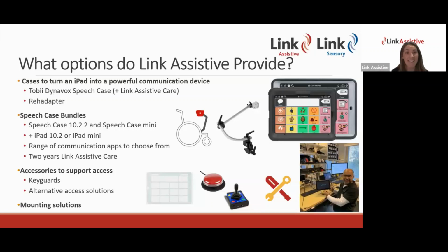We've also got some accessories that you might add to the iPad and the speech case. That might be a key guard, which you see down here, which can support with accessing the device, as well as some alternative access solutions like switches or a joystick when touch might not be accessible for your client. And we've also got some mounting solutions, so we can make sure that that device and that speech case is positioned really securely so it can be accessed.